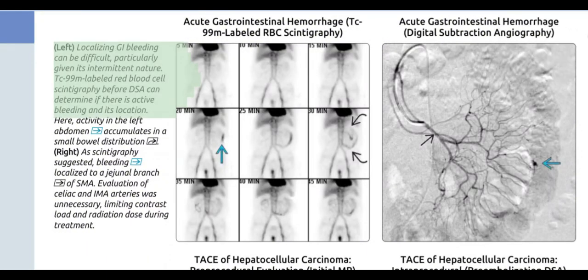Localizing GI bleeding can be difficult, particularly given its intermittent nature. Tc-99m labeled red blood cell scintigraphy before DSA can determine if there is active bleeding and its location. Here, activity in the left abdomen accumulates in a small bowel distribution. As scintigraphy suggested bleeding localized to a jejunal branch of the SMA, evaluation of the celiac and IMA arteries was unnecessary, limiting contrast load and radiation dose during treatment.